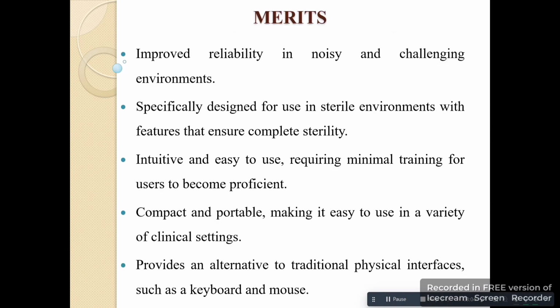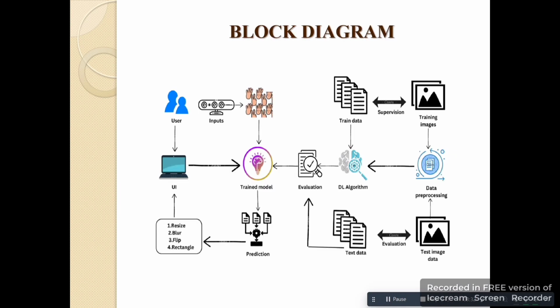Merits: improved reliability in noisy and challenging environments, specifically designed for use in sterile environments with features that ensure complete sterility. Intuitive and easy to use, requiring minimal training for users to become proficient. Compact and portable, making it easy to use in a variety of clinical settings. Provides an alternative to traditional physical interfaces such as a keyboard and mouse.